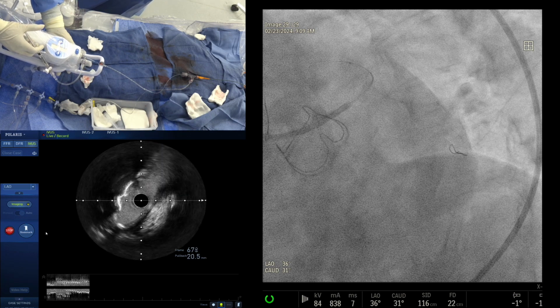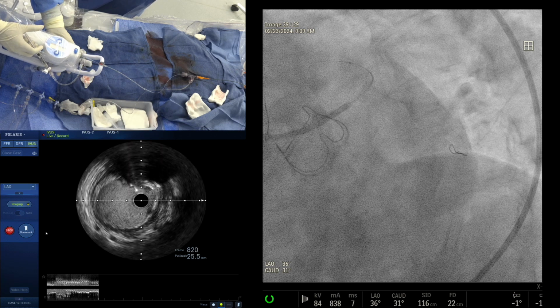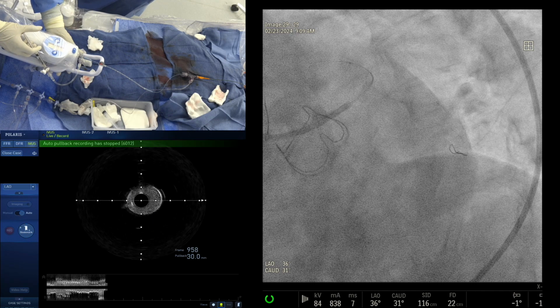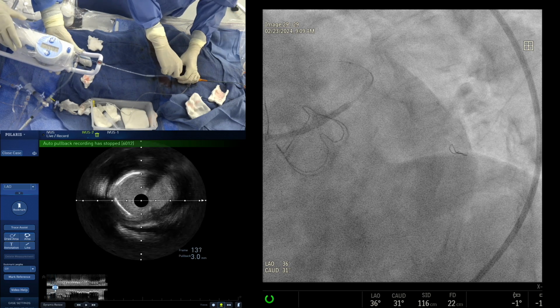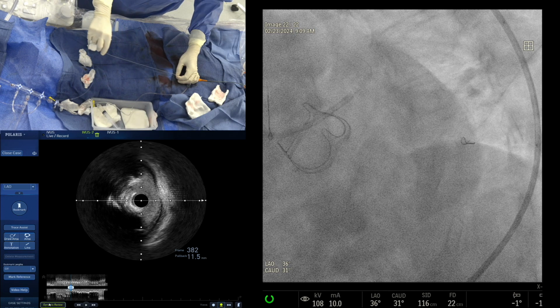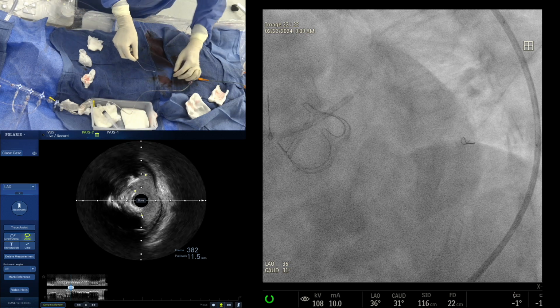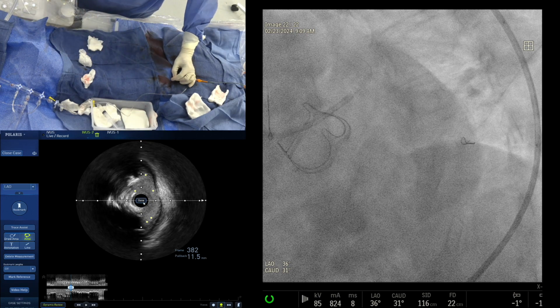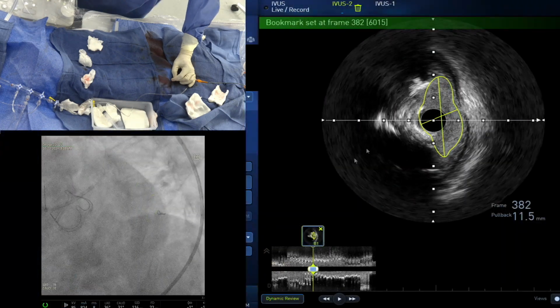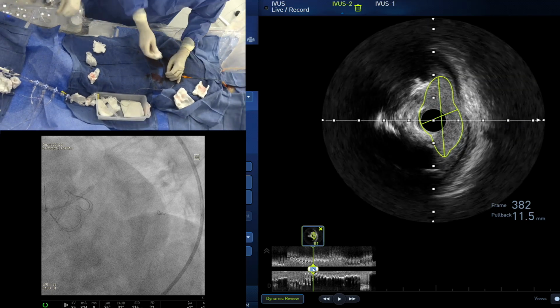And now come to the left main. Distal left main. So ostial LAD is patent, but the proximal LAD is very tight with the nodule. Okay, I will stop. Okay, good. So give us a cross-section at that nodule level of the LAD. Like here. Go to the circle. 5.2, like around 4, but eccentric, and the surface looks ablated.